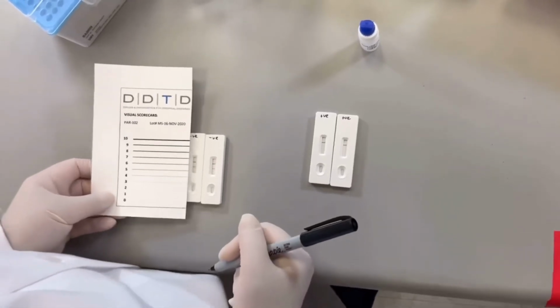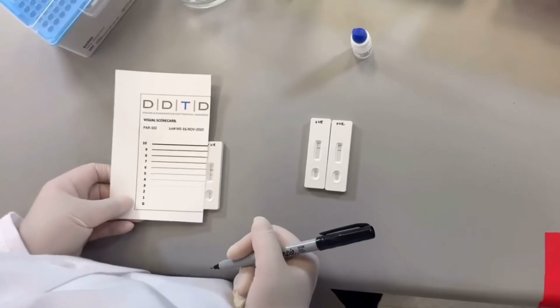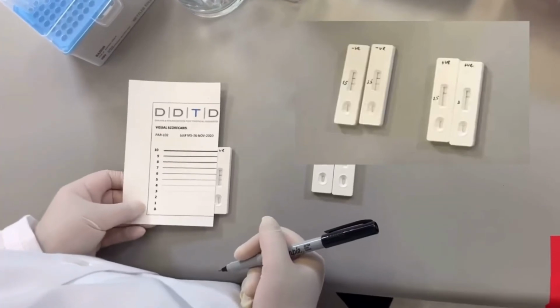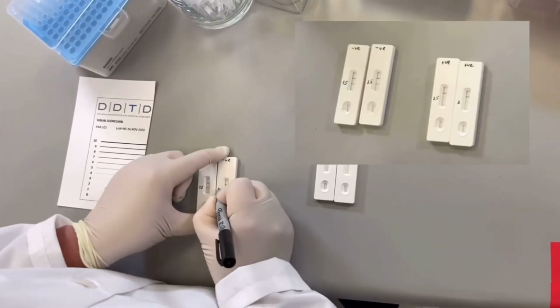Read the tests after 10 minutes and again after 30 minutes from the start time. Bring the test as close as possible to the test card and score the test line's intensity. Take a picture. Compare this test to the positive and negative controls.